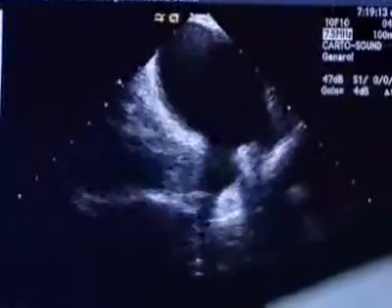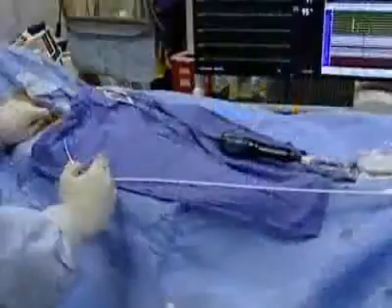What we call the septum of the heart, and this is the area where we're going from the right side of the heart to the left side of the heart. And on the bottom here are two pulmonary veins, both the left superior pulmonary vein and the left inferior pulmonary vein. That you showed us on the model just a few minutes ago. Exactly. Right. Lots of technology there, lots of screens to keep up with.